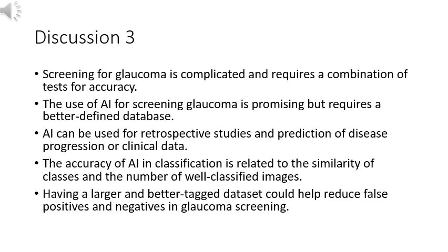For the purposes of our current research, we prefer to identify any stage of AMD in order to create future algorithms for classification. We believe that although early AMD will not threaten visual acuity in the short term, it should still be studied and monitored by the ophthalmologist.